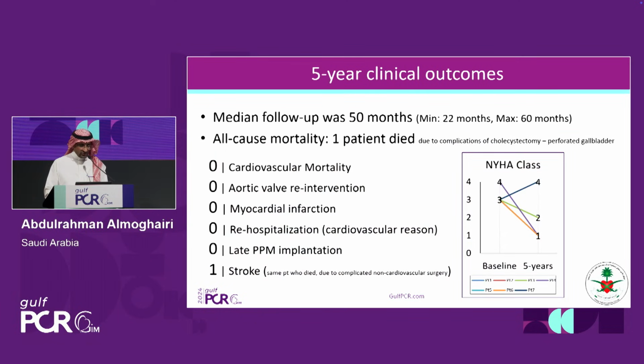We had a patient who later on had a minor stroke, and he was admitted with a non-cardiac condition, which was complicated cholecystitis and cholangitis, and he passed away a few months later with the complicated cholecystitis.